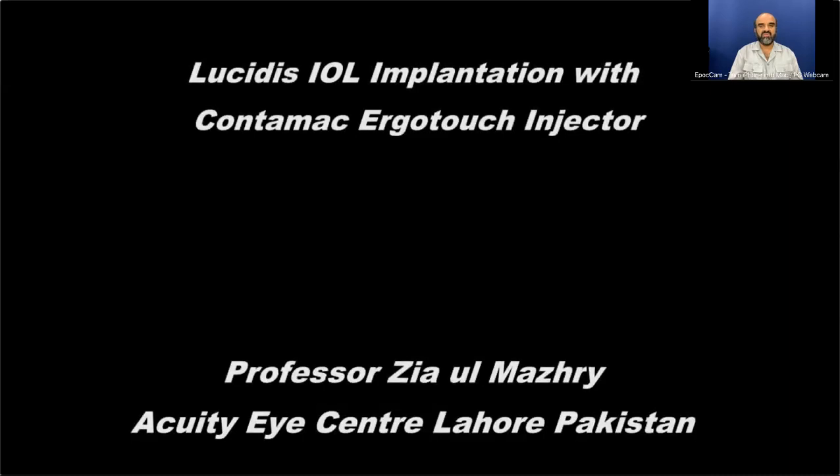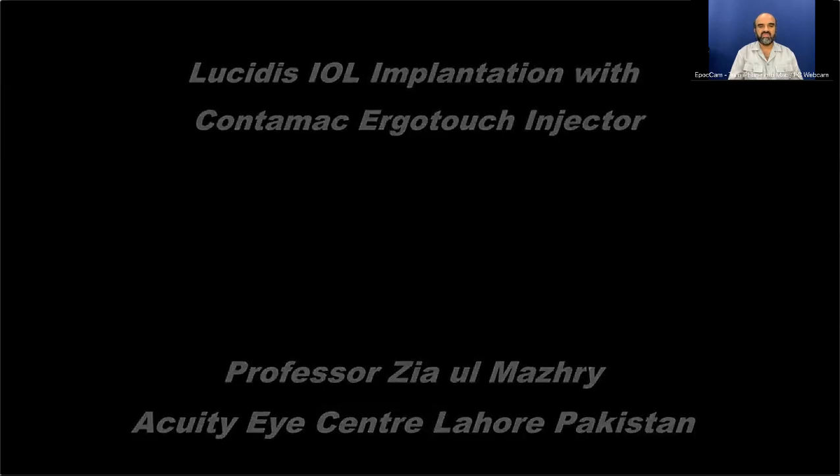So this was Lucidis intraocular lens implantation with Contamac ErgoTouch injector. Thank you very much for your attention.